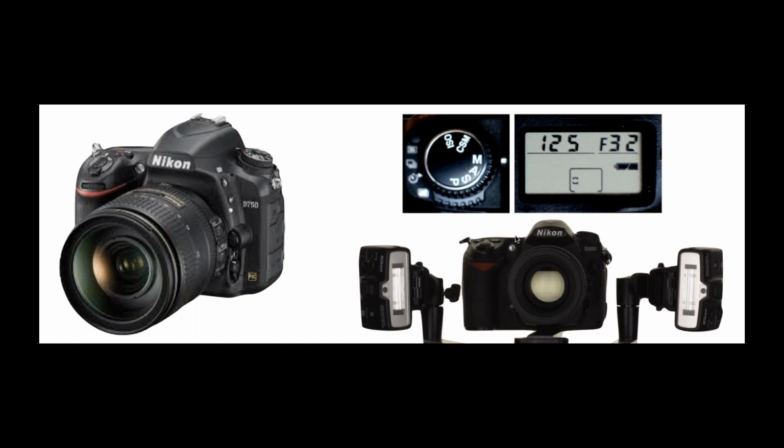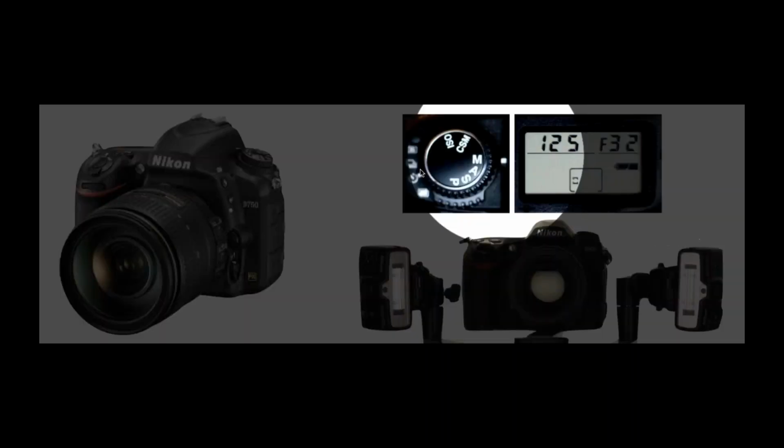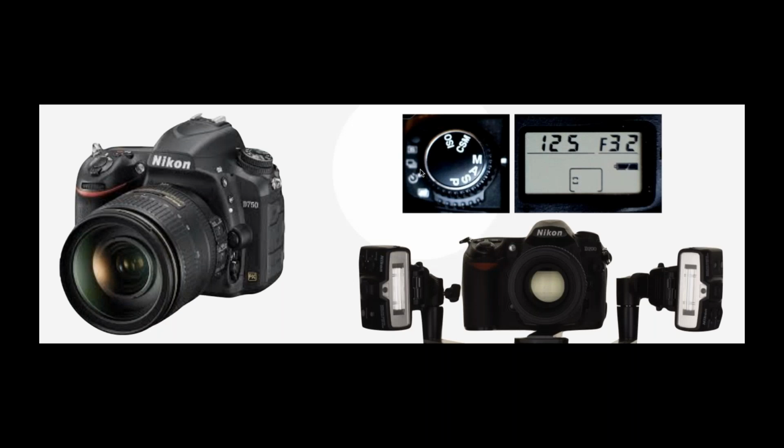It's kind of the nature of the camera. Once I'm set on a priority setting or an aperture setting, the internal components of the camera are reworking themselves every time you focus on a photograph or a person. I want to cut that out of the mix, and because of that, I only work on manual. The speed that I have my camera setting on is 125, and my f-stop is always f32 or higher, and I'll explain those two things to you.